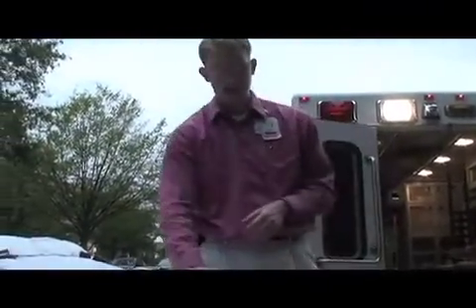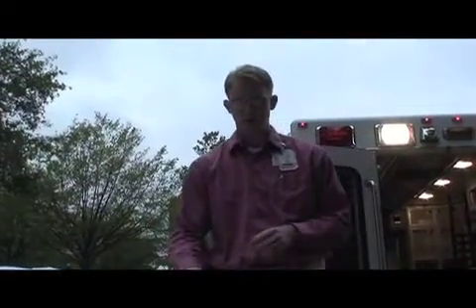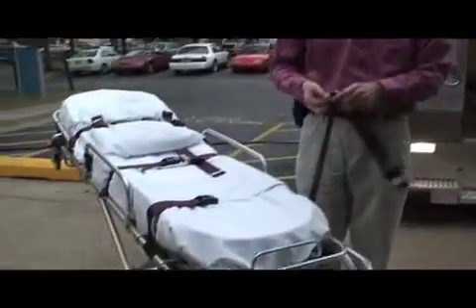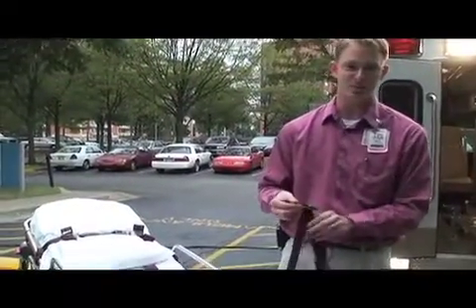So we have a strap system that we've set up that makes the straps look nice and presents a nice clean stretcher when you come in. And I'd like to show you how to put those on properly. A lot of times you'll find that the stretchers are not this way, which is my pet peeve. So if you see one that's not, I would appreciate it if you would set it up appropriately.